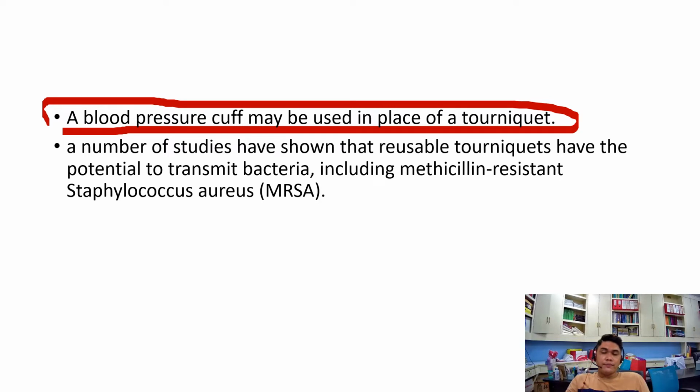That's the maximum. A number of studies have shown that reusable tourniquets have the potential to transmit bacteria, including methicillin-resistant Staphylococcus aureus. Because of this possibility of transmitting MRSA, it's advisable to use a disposable, single-use tourniquet. But no organization or institution requires all laboratories to follow that rule.